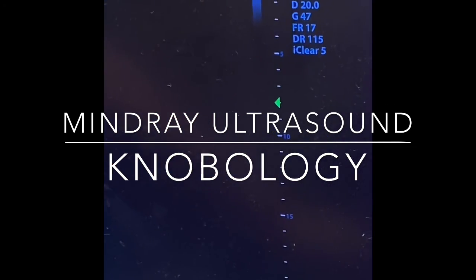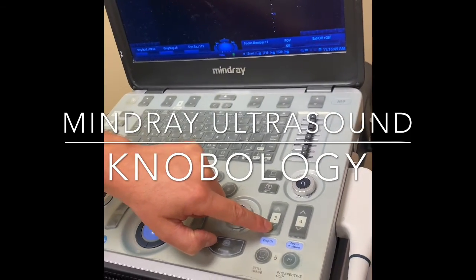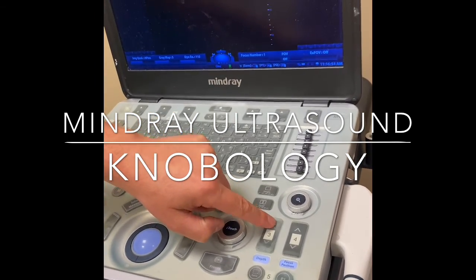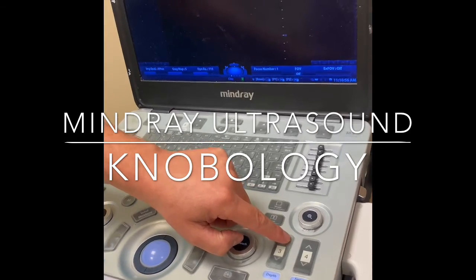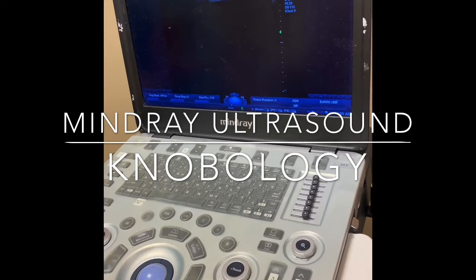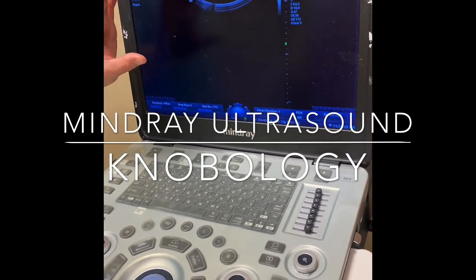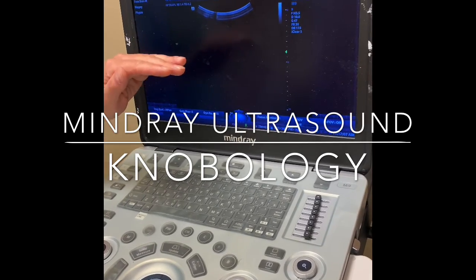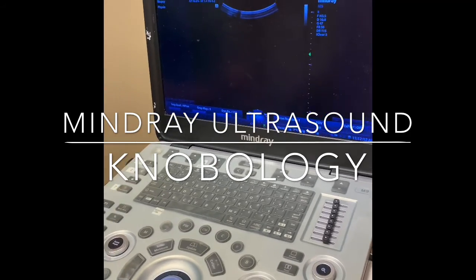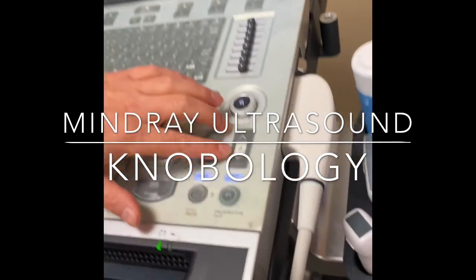If you press the down button, you go deeper. And you could see it goes deeper 1 centimeter at a time. Now we're at 25 centimeters. If I press the up button, I decrease the depth. Now we're at 10 centimeters. You want to make sure to have the minimum depth you need to still see the structure and slightly beyond. If you have too much depth, what you're looking at will appear very small, and it will be difficult to identify pathology.